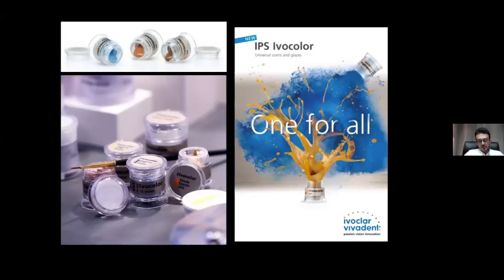Regarding myself, I use different systems. Of course, for Emax, I use Ivo Color. It started with a system called Emax Ceram Shades. Then they used some powders from a system called Essence, plus the Emax Ceram Shades, to produce the final kit, which is known as Ivo Color. This is what I use for Emax lithium disilicate restorations.